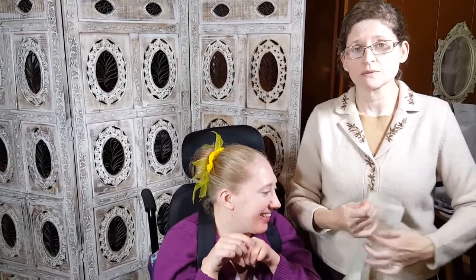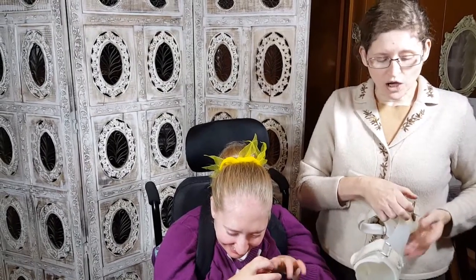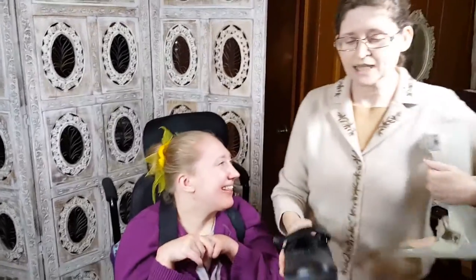Micah's been wearing these since she was too young to remember not wearing them — she's been wearing them for a long time. She wears a four and a half wide shoe. It has to be wide in order to get the AFO in there.